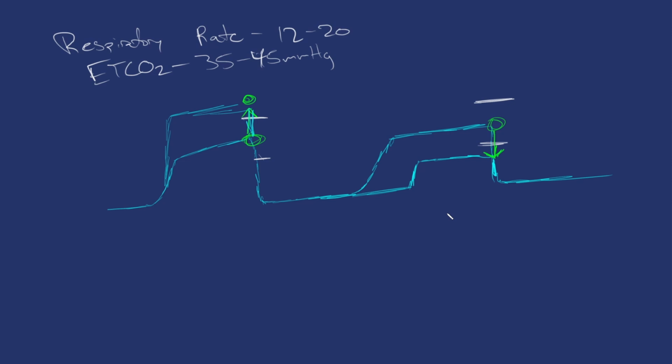So this is where the end tidal will be very, very useful, especially in procedural sedation areas where we're looking at their airway and their overall respiratory function. It gives a very quick look at that respiratory function. If we're seeing respiratory rates or end tidal rates that are outside the norm, we have to go and look at everything else, right? It would be a bigger issue if we're seeing an end tidal outside the norm with a normal respiratory rate, or if something's moving in a different direction.